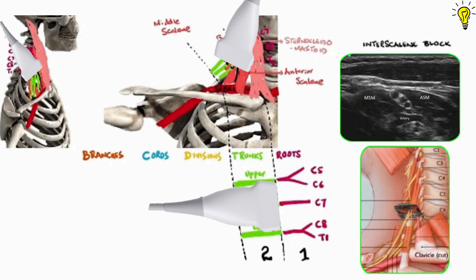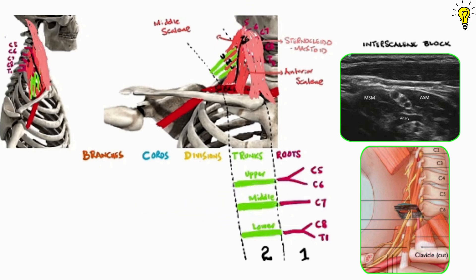Now in the ultrasound image, we can see the fine traffic light signal. Roots C5 and C6 almost about to join to form upper trunk and C7 root forming the middle trunk. The lower C8 and T1 are usually spared in interscalene block, so ulnar nerve area is spared. Notice how the roots or trunks, they are sandwiched between the bellies of anterior scalene and middle scalene muscles.